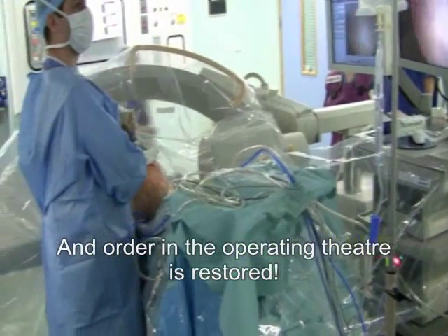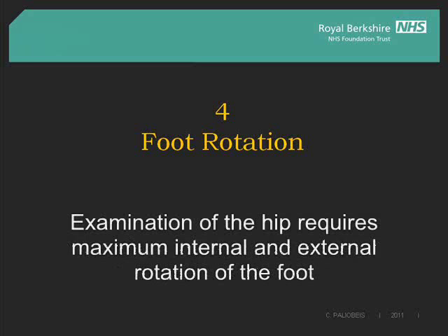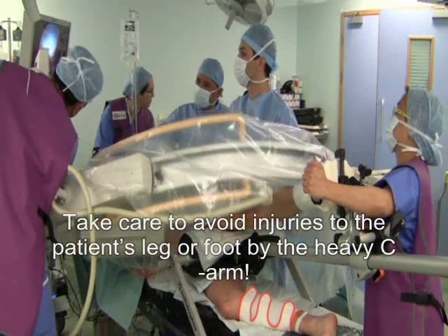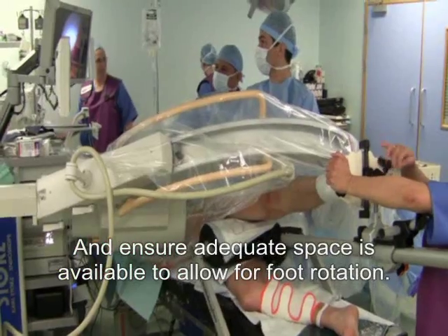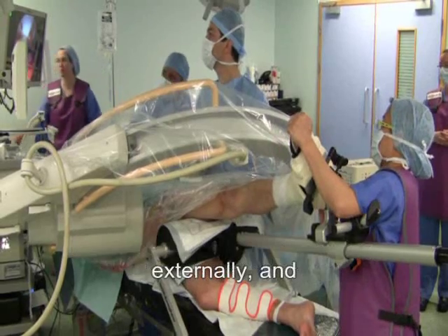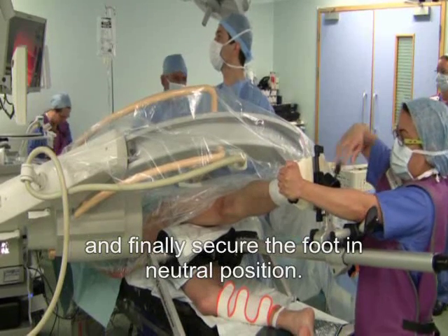The first stage of a hip arthroscopy is usually spent under traction. Examination of the hip requires maximum internal and external rotation of the foot, performed by a member of the team who is not scrubbed. Take care to avoid injuries to the patient's leg or foot by the heavy C-arm, and ensure adequate space is available to allow for foot rotation. Release the foot plate securing knob and rotate the foot externally and internally, and finally secure the foot in neutral position.